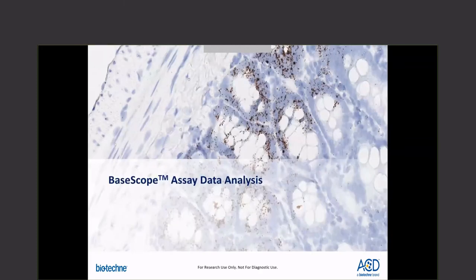Coming to BaseScope data analysis, BaseScope signal appears as numerous punctate dots, either red for the BaseScope red chromogenic assay or green and red for the duplex assay. These dots are of various sizes and intensities, and sometimes a few clusters may also be seen. Typically, it is the number of dots and clusters that are important rather than the intensity of the dot. Each dot represents one mRNA molecule. When multiple mRNA molecules are present, the signal appears as a cluster.